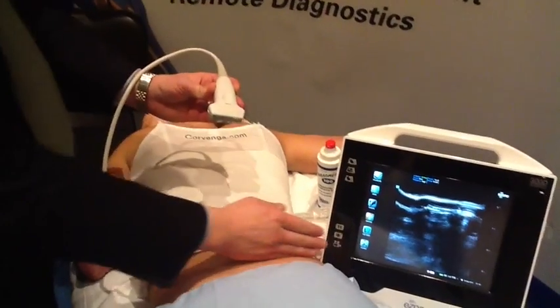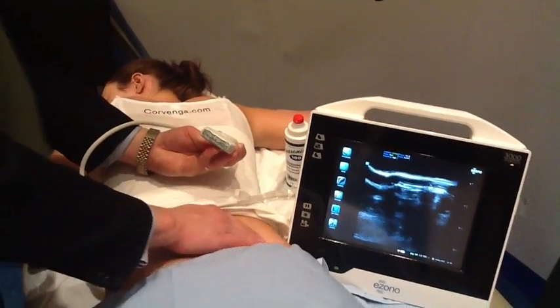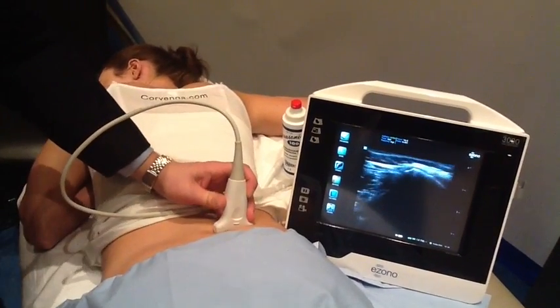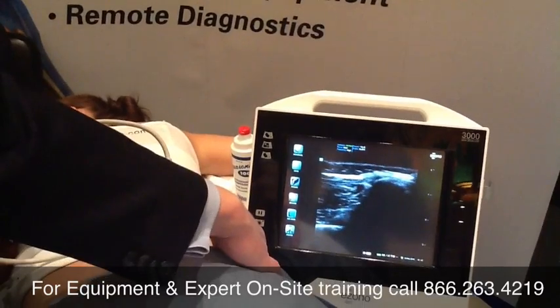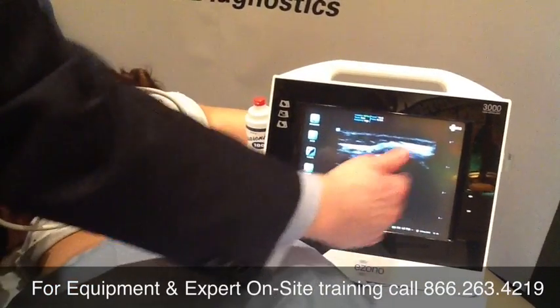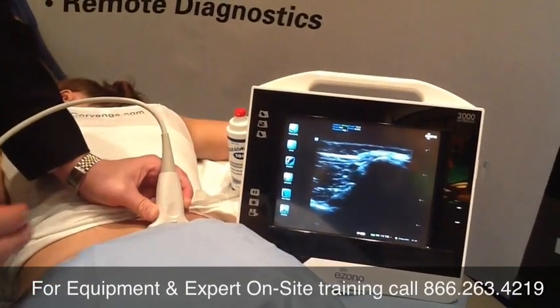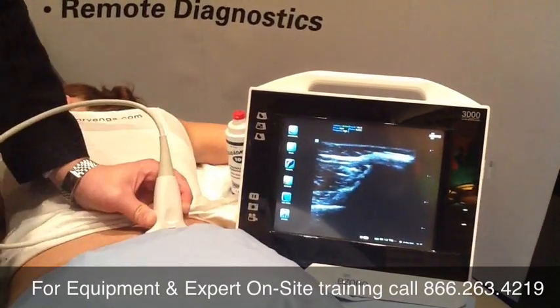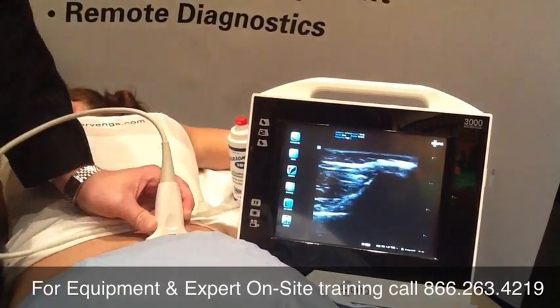I'm going to take the probe and go transverse to the anatomy. I'm going to place it down by the PSIS up high. As we look at the patient, the lateral side is on the right. On my ultrasound screen, the lateral side is also on my right, with medial being on my left. In the image, we can see right here is the iliac crest, and right here is the sacrum.